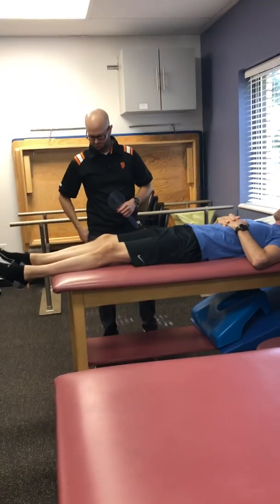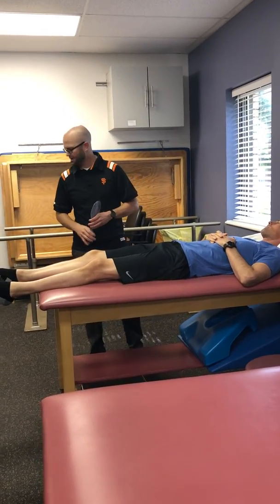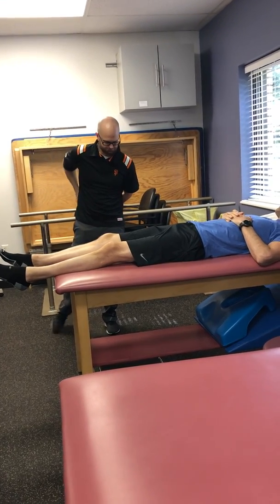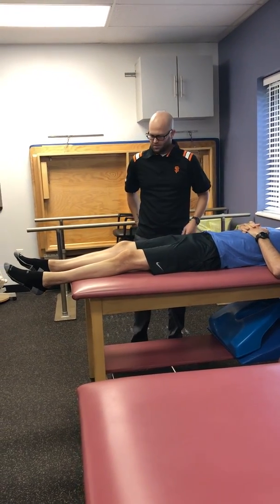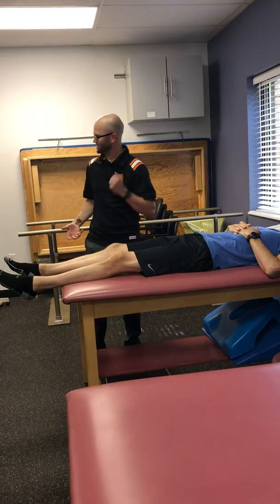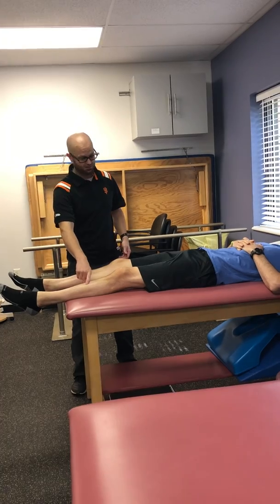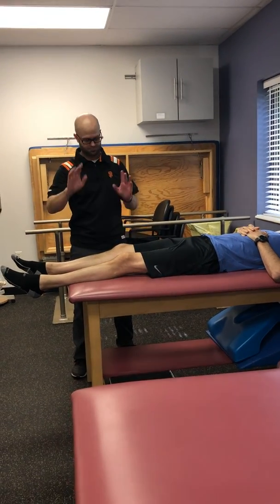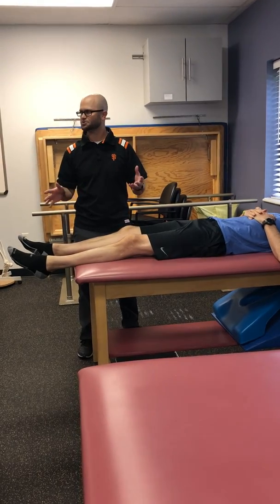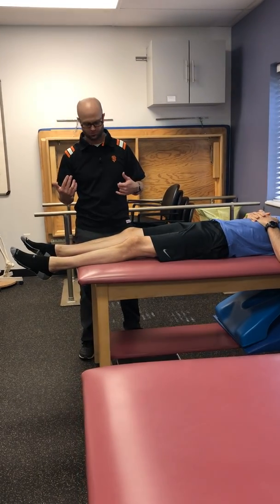Let's say we want to measure his abduction on his right side. What am I going to do? Okay, so first, I would do the left. Take my measurement there to get my baseline of just the motion that I'm taking. We'll do passive range of motion for this one, okay?